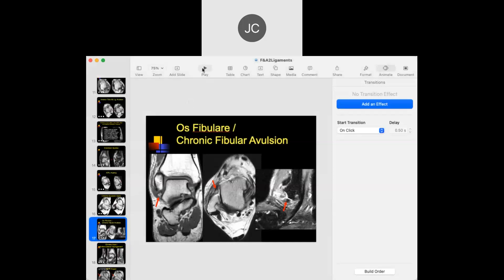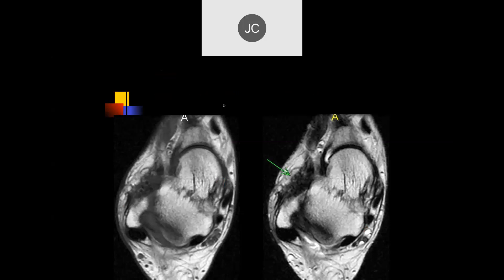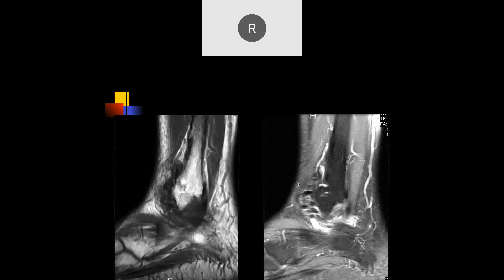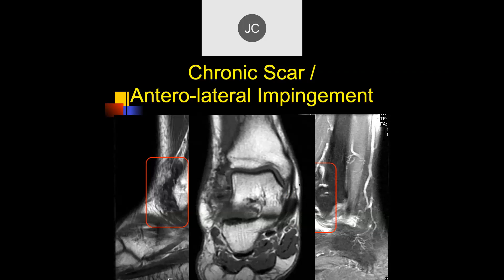We'll continue from where we left off before. Robert, what do you think of this case? It looks like there's a lot of soft tissue scarring where the ATFL should be. And if we go to the sagittal images, we see more soft tissue scarring, maybe some calcification. You've got to even be concerned whether the patient had prior surgery in this, which I think they did. So this is scarring here, and this is going to be what we call anterior lateral impingement once we talk about impingement syndromes.